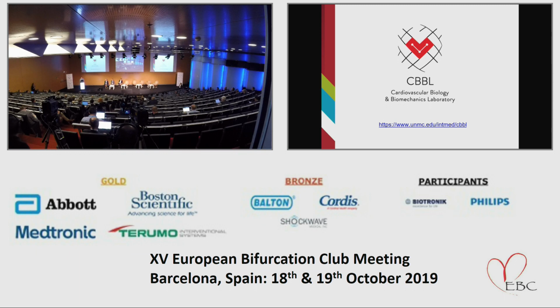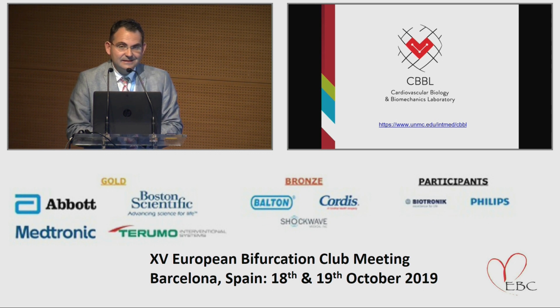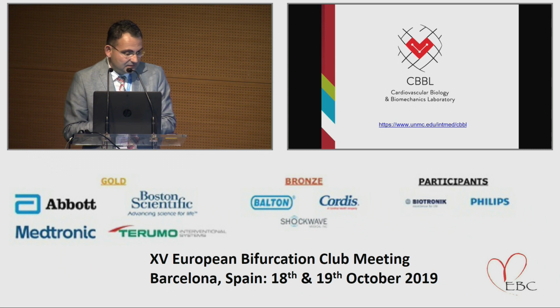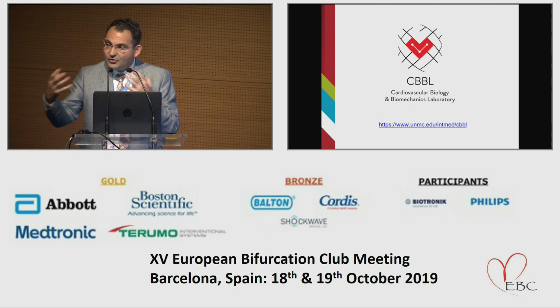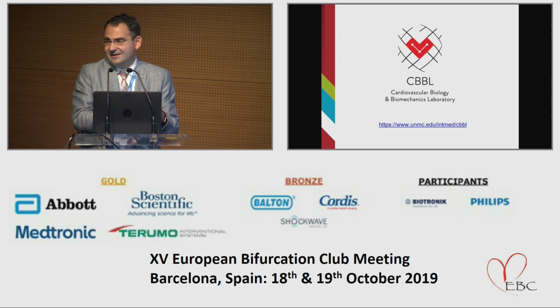Yes, thank you, that's a very key point here. That recoil, as Tim Mackey said previously, is happening with every metal, and that's something that we should always take into account. Recoil of the stent is dependent on two factors: on the stent material itself and the radial strength, essentially, which is dependent on the design and the metallic properties, and also on the tissue. So both should be considered. It's a different recoil when you expand the same stent within a very stiff calcified vessel versus a very lipid-rich vessel.